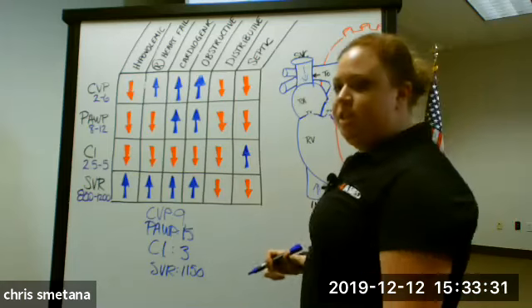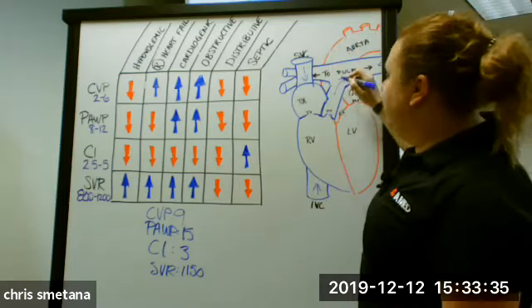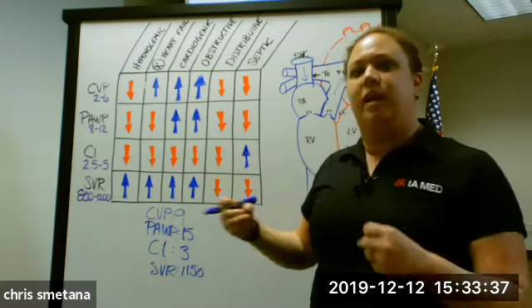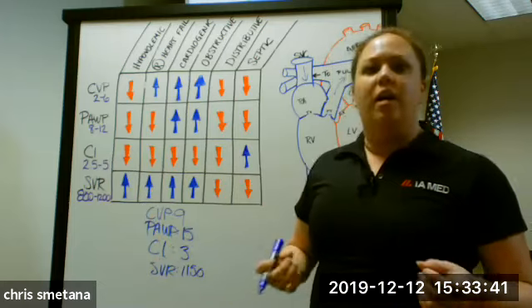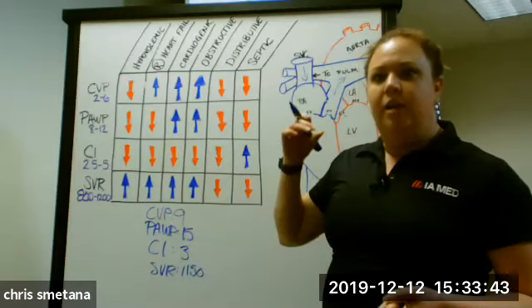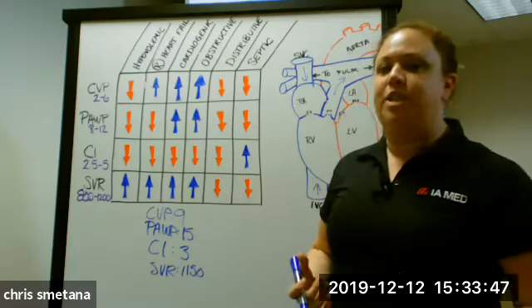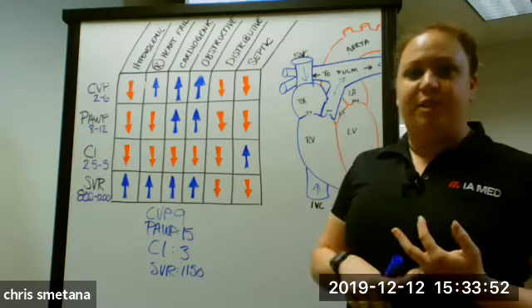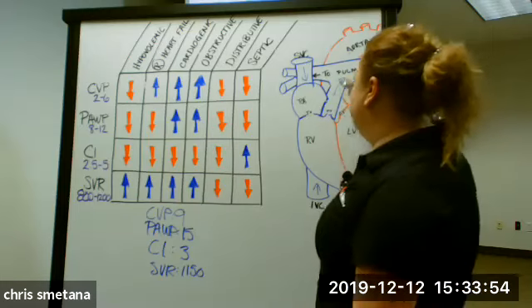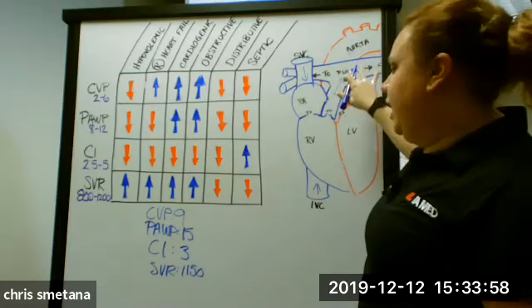I go through and I look at my wedge pressure. My wedge pressure is at 15, which means as I'm trying to go into the pulmonary arteries, as I'm getting towards the end of that, my pulmonary capillaries, they're under high pressure. The pulmonary capillaries don't like to be under high pressure. When we have increased pressure, now we're running the risk of pulmonary capillary leakage, which long-term is going to cause significant lung problems, right? So I have increased pressure going out into the pulmonary capillaries.